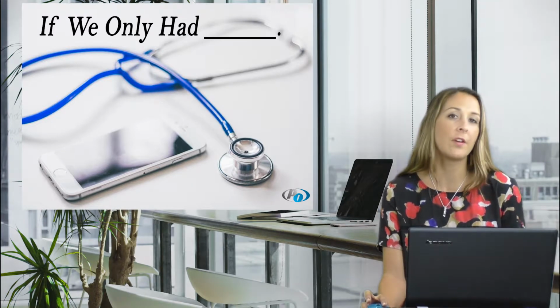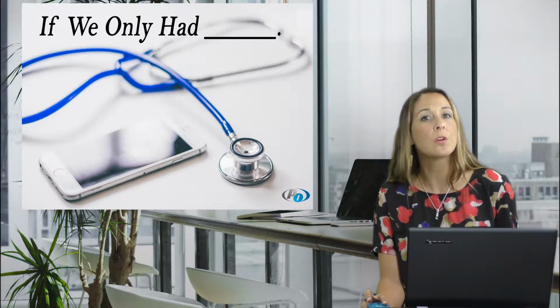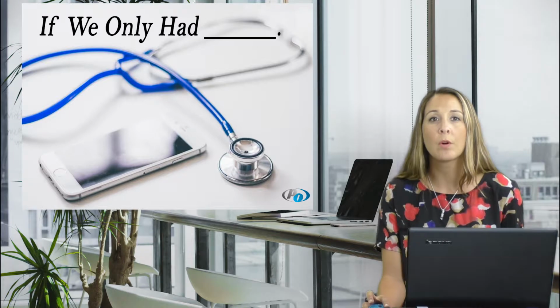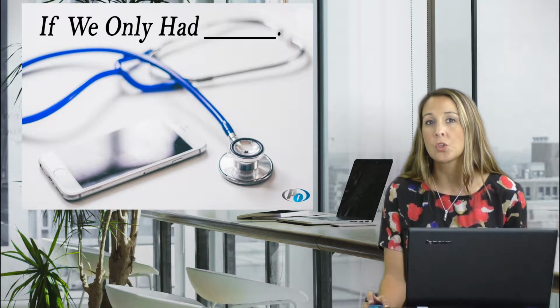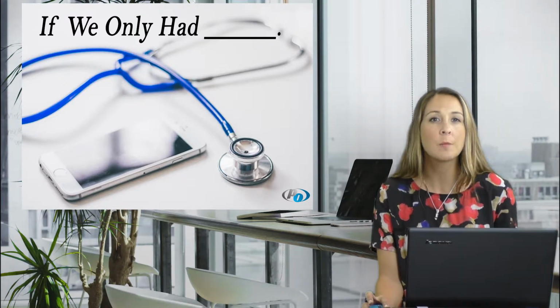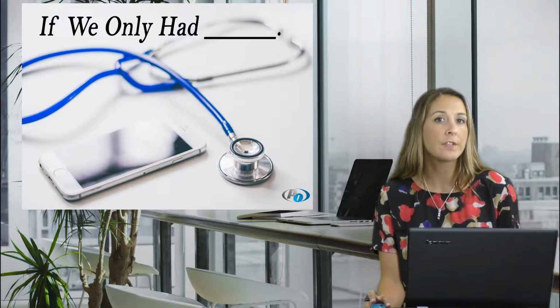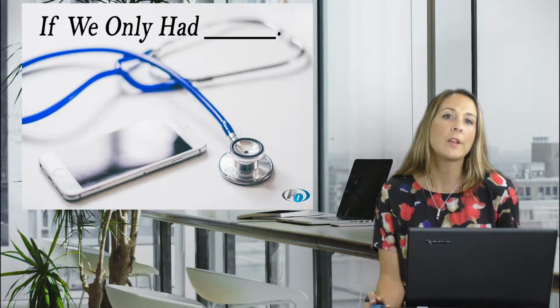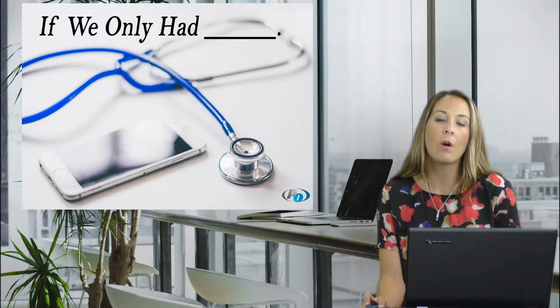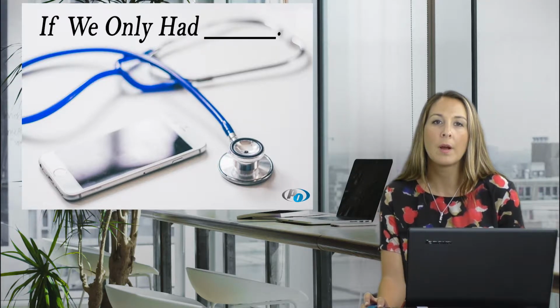Now, the third one is called Dialed In Motion, and this may be for clinics who are doing a little bit more running analysis, or they may be fitting patients with shoes. This software allows you to compare 4 different types of shoes or interventions. So if you are maybe comparing 4 different types of AFOs, then you may want to use something along the lines of Dialed In Motion. Now, feel free to check those out on our website. You can get a link to them through the website.